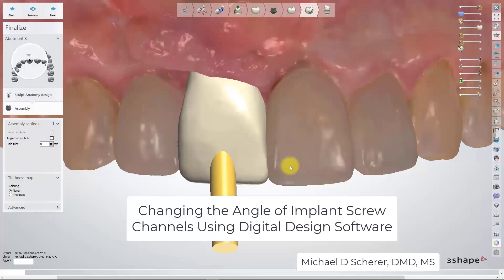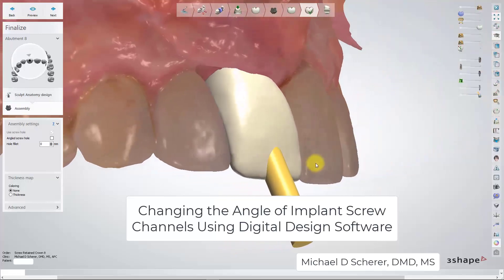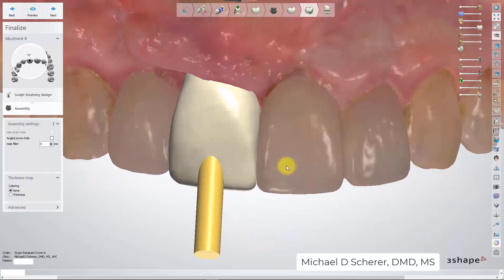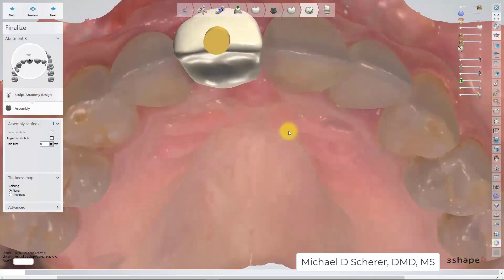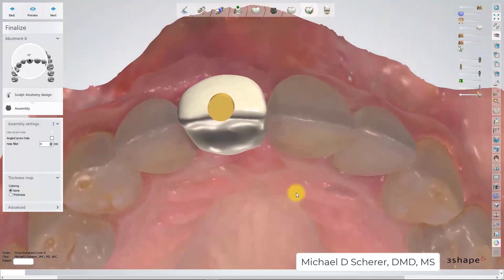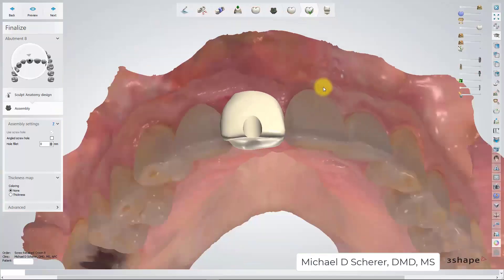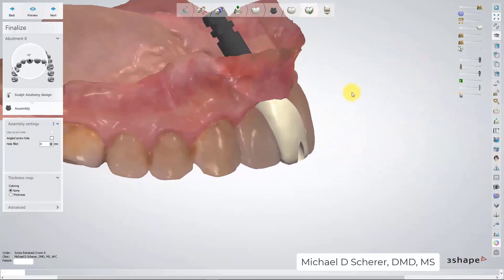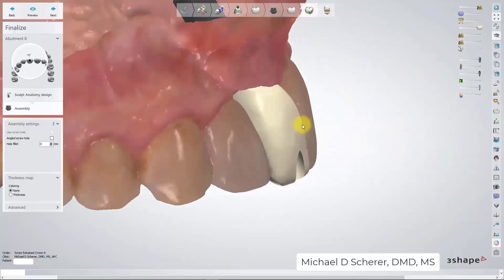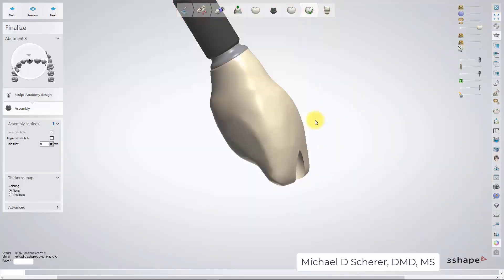This is Dr. Michael Shear. In this video, I'm going to show you how I utilize some of the built-in software capabilities of angled screw channel. In this specific case, we have tooth number 8, where the implant angulation would normally put the screw access channel for the restoration through the incisal edge of the crown.